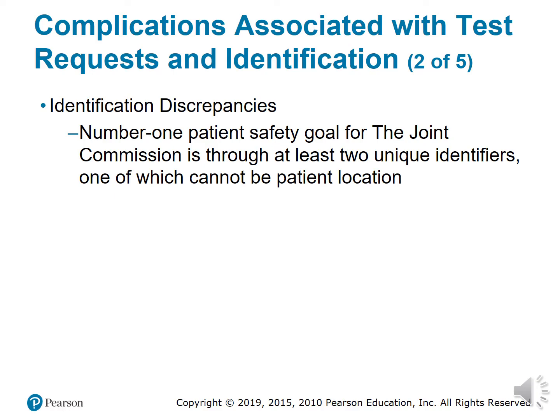And the thing of it is, we have to be very mindful and very critical on identification of patients due to that one interesting fact that we have a lot of people who have a common name and they just might have a different birthday. It's very rare that you run across somebody who has not only the same name but the same birthday. It does happen. It's happened to me at least twice, but it's rare, but it can happen.